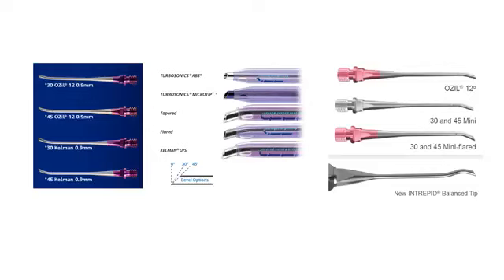The phaco tip has 3 main roles: a jackhammer effect, cavitation, and as a flow restrictor. The shape and size will impact the fluidics and the power of the ultrasound, and suitability will depend on your technique of choice and preference.